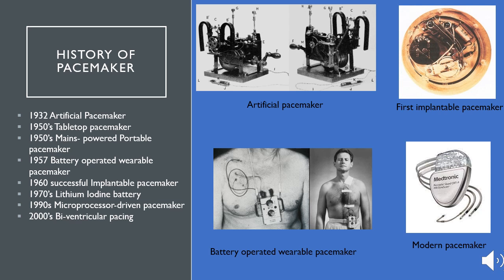In October of 1958, the first pacemaker implantation was performed. The entire unit was entirely handmade and consisted of nickel-cadmium batteries, the electronic circuit, and the coil recharging antenna. These were encapsulated in a new epoxy resin which had excellent biocompatibility. The first pacemaker implanted functioned only a few hours, but the second one implanted in the same patient had better longevity. However, it only lasted about a week, and it was suggested that there was probable lead fracture rather than pulse generator malfunction.